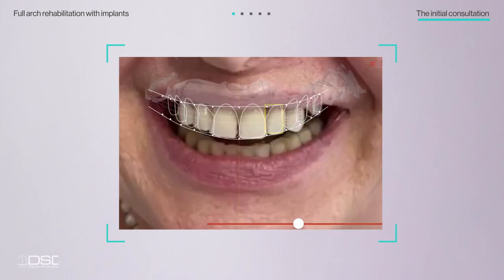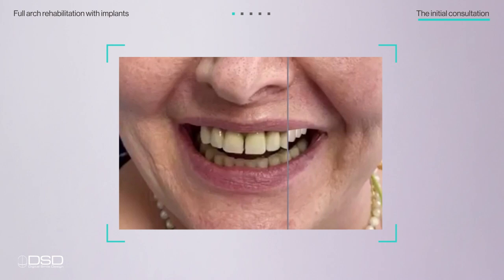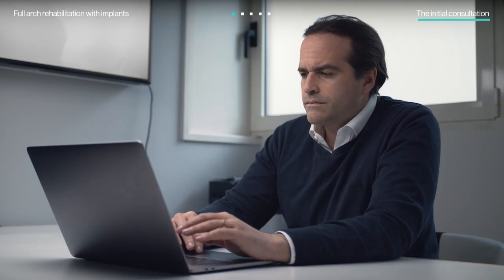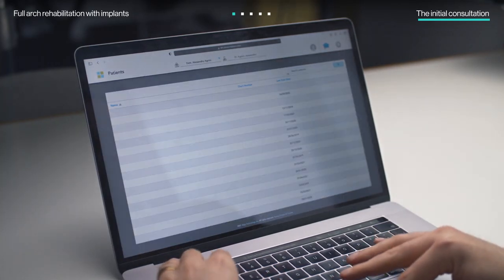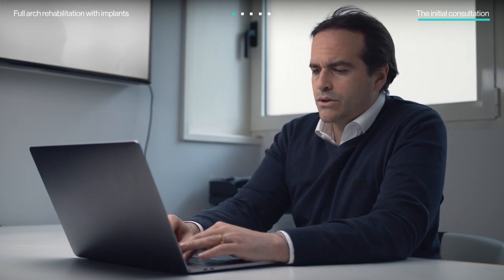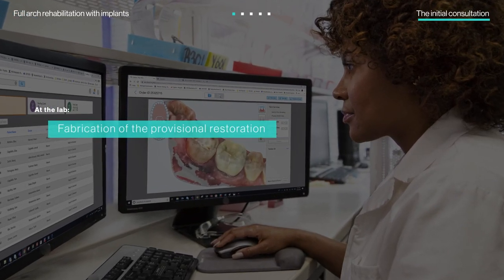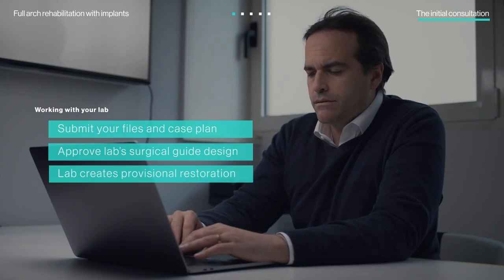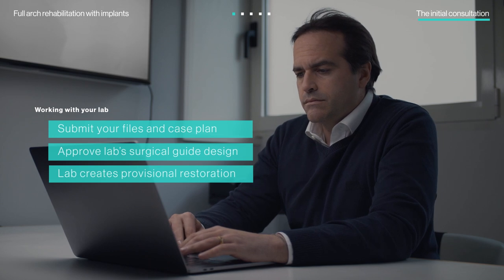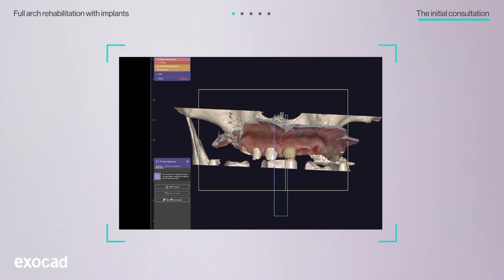To clearly communicate the proposed treatment, the doctors used the DSD Smile Design tool to simulate the treatment outcome. The iTero scanner's open system allows for easy transfer of files to chairside and lab software. Once the doctors captured the scans, they were able to share them, along with the case analysis and diagnosis, directly with their lab to help with case planning and surgical guide fabrication. After capturing patient images, the doctors coordinated with the lab.